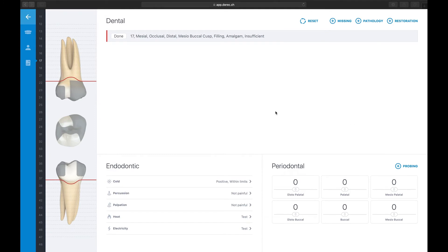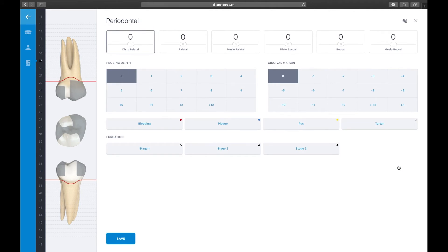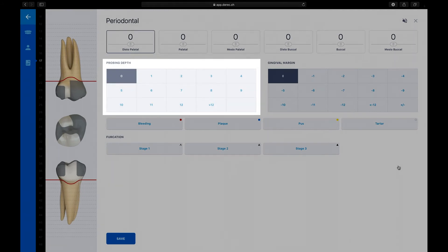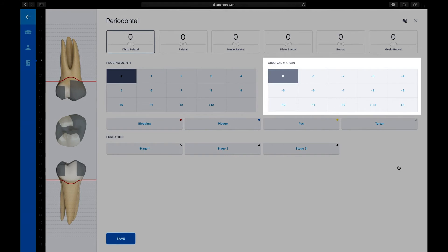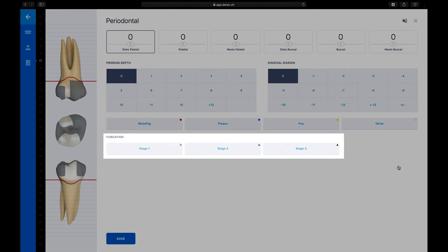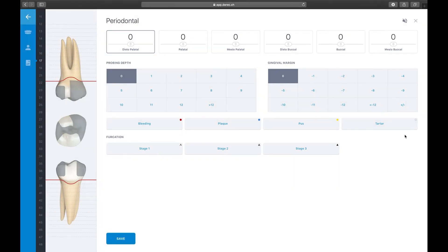Let's record the periodontal situation on tooth 17. To enter periodontal findings, press on the Add Probing button. Derek will show you the period pad for entering data. The period pad consists of five different sections: the six measuring points you can select to enter data, the probing depth pad, the gingival margin pad for recording recession or a hyperplastic gum line, buttons for adding bleeding, plaque, pus, or tartar, and in multi-rooted teeth, you will also be able to record any furcation involvement.